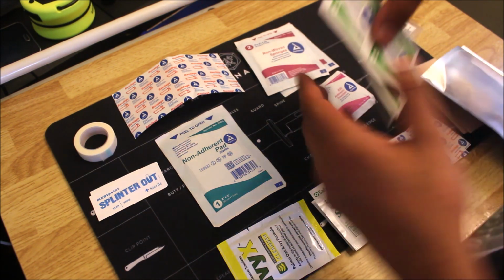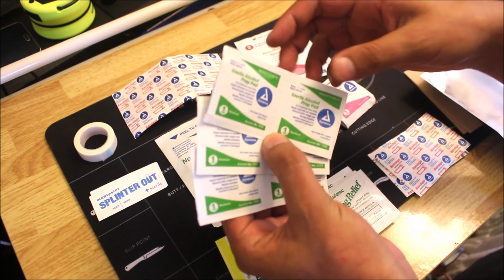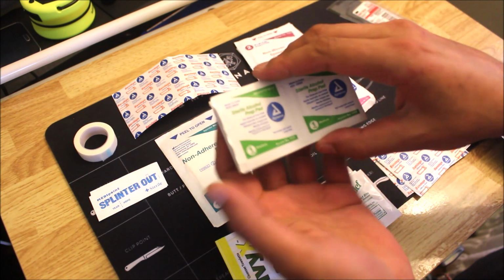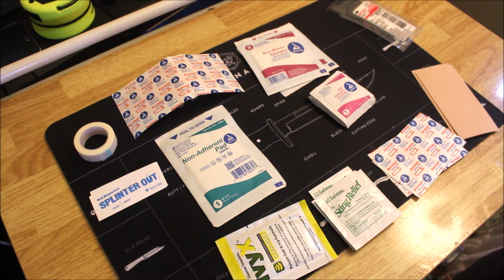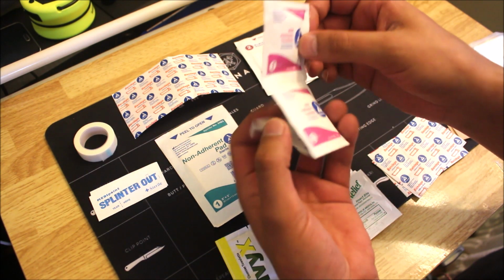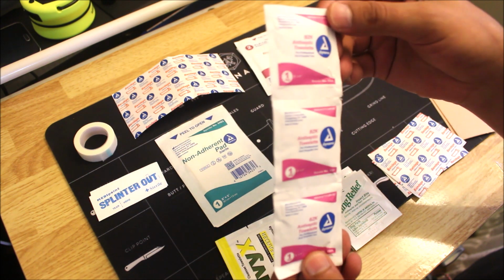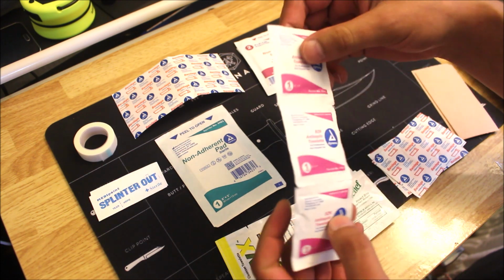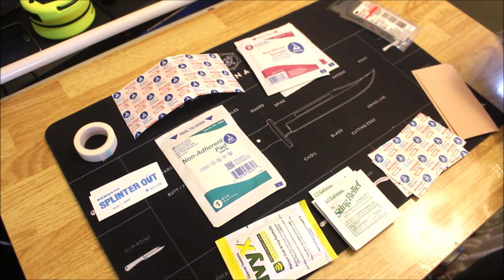Alright, right here we have some alcohol prep pads. We have 6 of these. Of course, these are for cleaning off the area before you apply bandages and whatnot, and keep down infection. So those are good to have. Let's see, then we have 3 BZK antiseptic towelettes. Again, I think that's just for cleaning up the area to prevent some infection. I'll just go ahead and break these apart and put them back in the bag here.